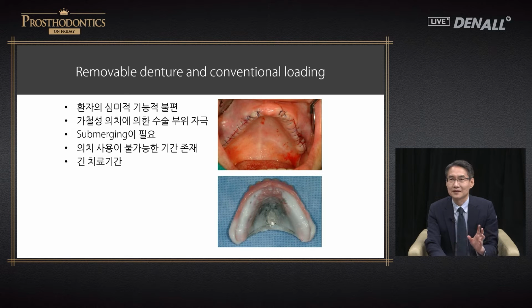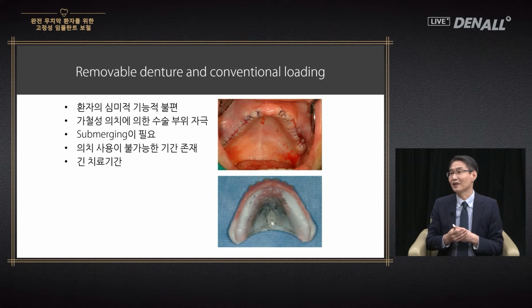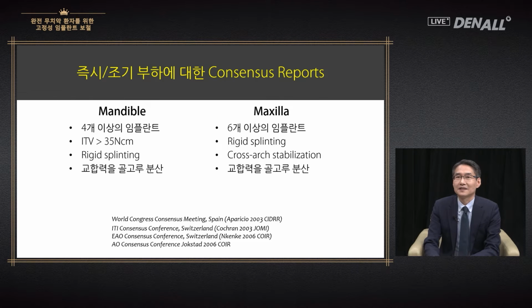Also, at times, right after first or second surgery for a couple of weeks, the patient will not be able to use the denture, so this can be quite problematic for the patients. This is a major stress for those wanting to receive implant treatment. Living without teeth for a couple of months is difficult, and therefore, I prefer immediate loading.